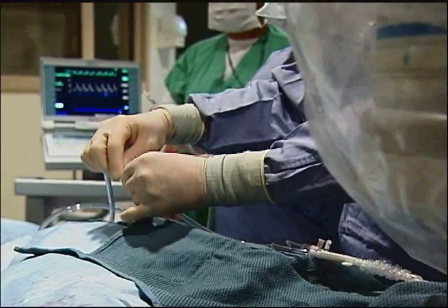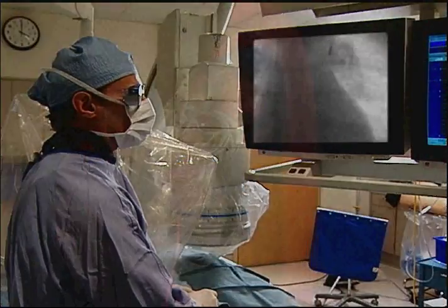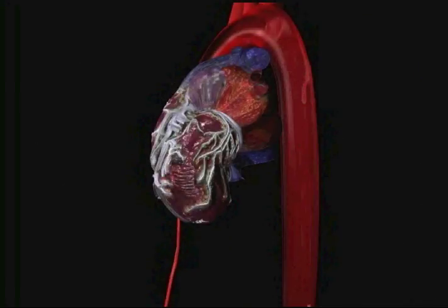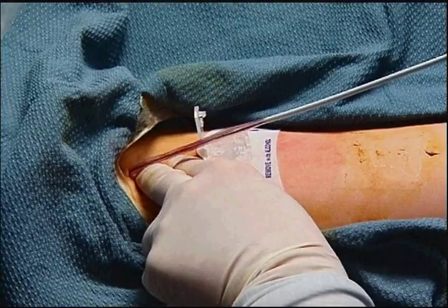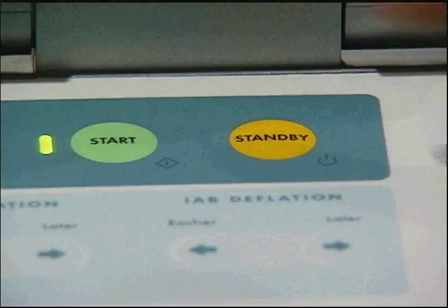Attach the male lure of the extender to the pump console and initiate pumping. An intra-aortic balloon can, under unusual clinical conditions, be inserted into a false lumen of the aorta. If blood is seen within the balloon catheter tubing, stop pumping and remove the balloon.